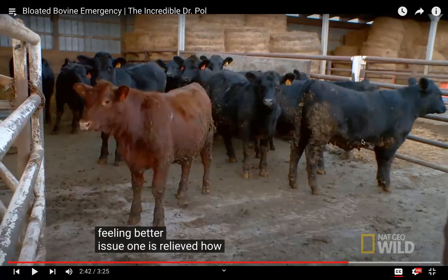And think of it, that's going to be as painful as getting a piercing done. It's going to be a quick, sharp feeling of pain, but then that cow is going to feel such an immense amount of relief, because that gas now has a hole to escape from that rumen, that they're not even going to really care or pay attention to that one poke. They're going to be more focused on the feeling of relief.